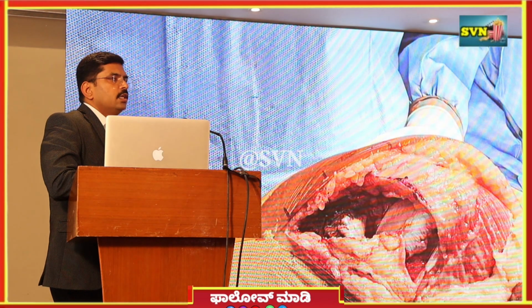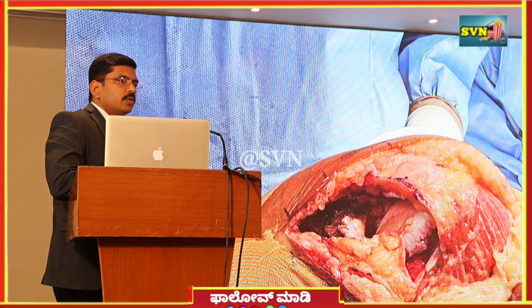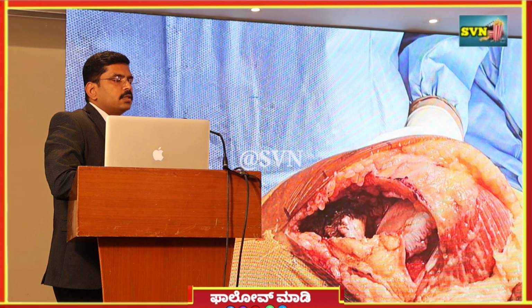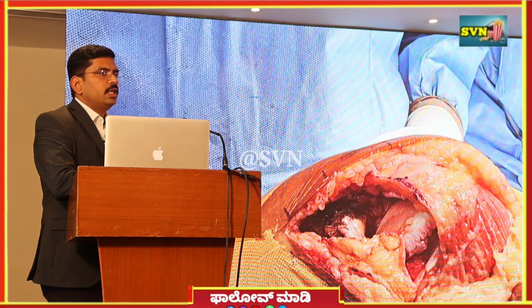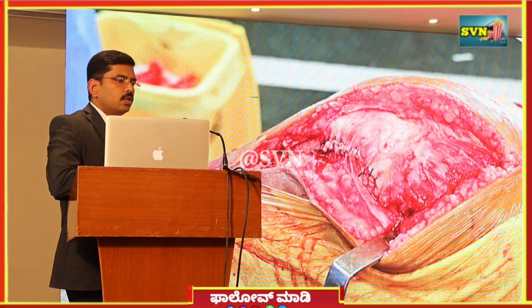With the small incision, without cutting the muscle, this is what is called the subvastus approach. Without cutting the muscle, we can perform the surgery. The advantage of this is definitely the wound size is less. Since we don't cut the muscle, the muscle loss or muscle weakness is less, so the recovery is faster and better, and there is no need for aggressive physiotherapy, and definitely it can be conveniently done in older age because the blood loss is less and the pain factor is less. So once the surgery is done, the closure, that is.